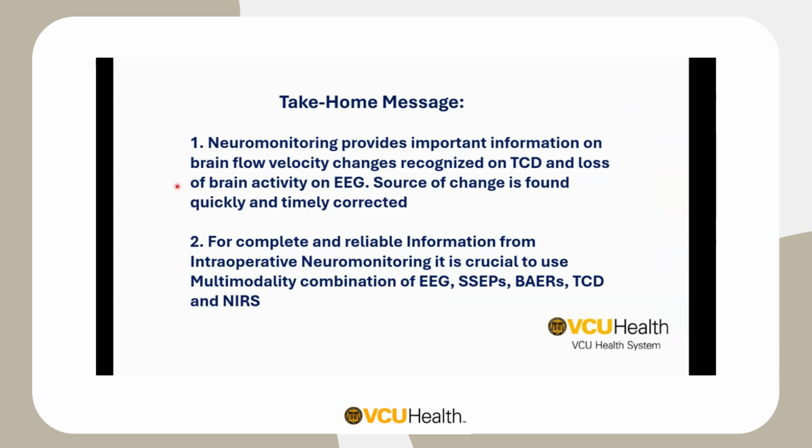Source of change can be found quickly and timely corrected, as I showed on my previous slides. For complete and reliable information from intraoperative neuromonitoring, it is crucial to use a multimodality combination. This is the point of my presentation. So we should use EEG, evoked potentials, TCD, and NIRS. In this case, we have a complete picture of what's happening with the brain, if the brain is underperfused or overperfused.